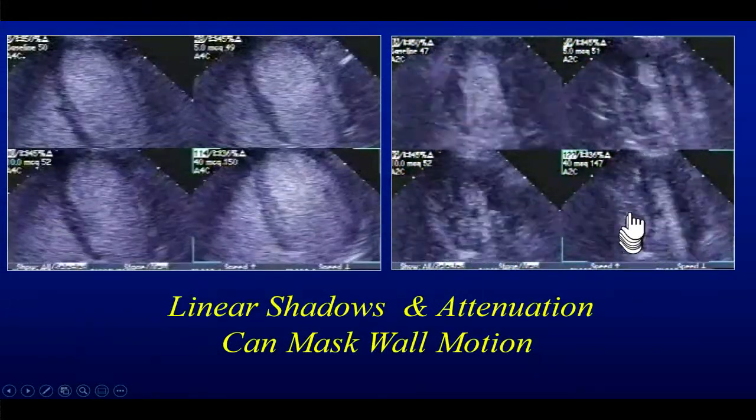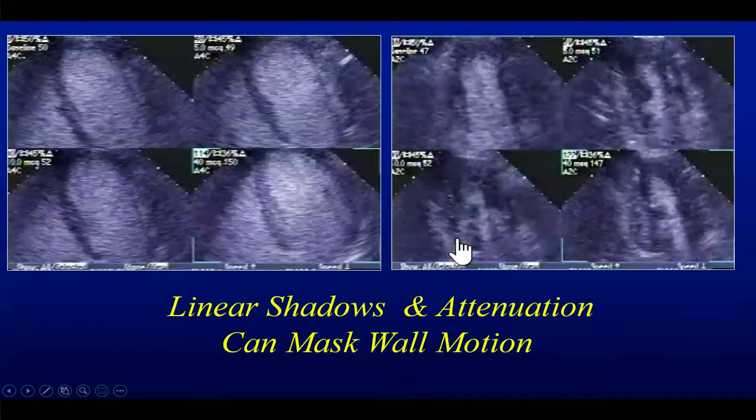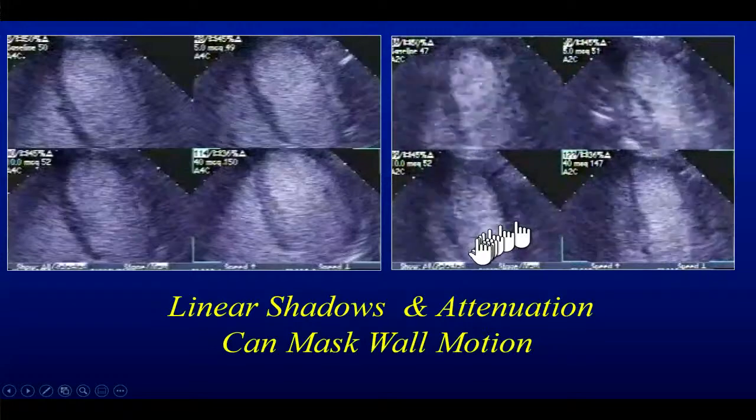However, here, it is interfering with my interpretation. And actually, the endocardium is way down here. See where it is? There's a wall motion abnormality that has occurred at 10 mics already.